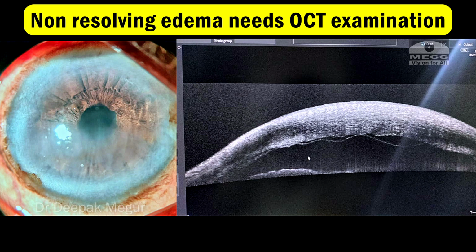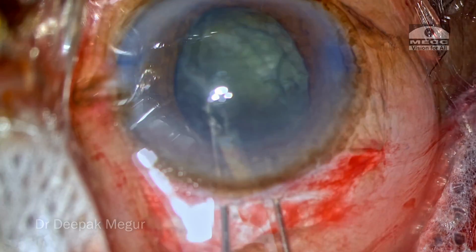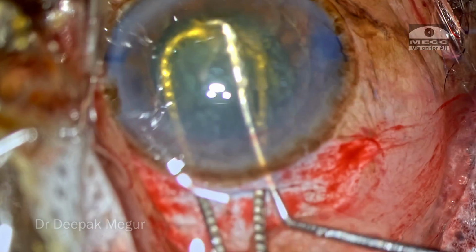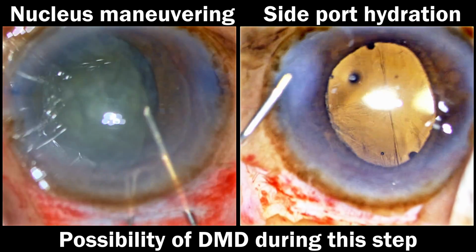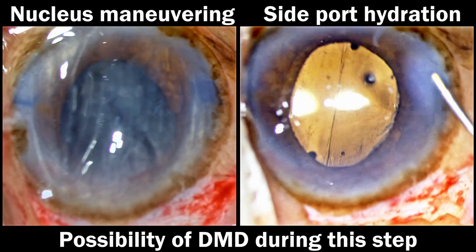The first lesson is, in a non-resolving edema, always get an OCT done. That really helps us to rule out Descemet membrane detachment. Now the operating surgeon did not have an idea when it happened, so we went back and tried to look at the videos and it wasn't very conclusive at what stage it happened. The only guess was that it would have happened during nucleus maneuvering, or a second option would be during the side port hydration. So these are the two steps where it was suspected that the Descemet membrane detachment would have happened. Nevertheless, now we need to manage this.